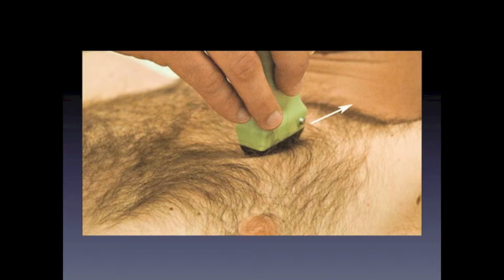We can then evaluate for a pneumothorax in the same manner that you would in an EFAST. Place the linear transducer in the superior portion of the chest at approximately the 3rd to 4th intercostal space midclavicular line, with the marker dot pointed cephalad on the side of the chest where the catheter was placed. It is best to adjust the probe linearly until 2 ribs are seen on each side of the image.